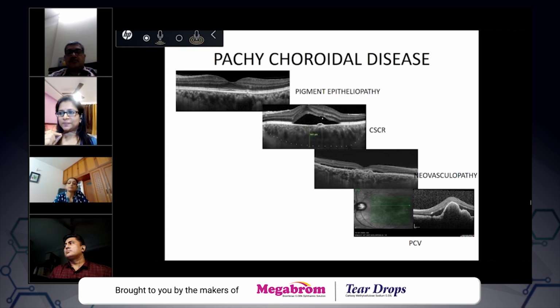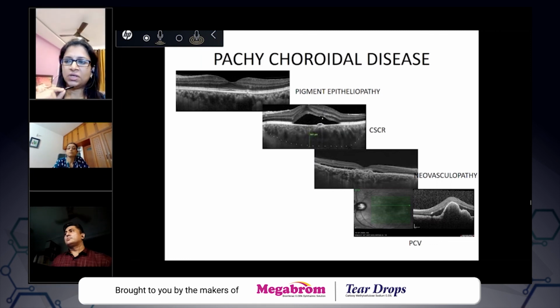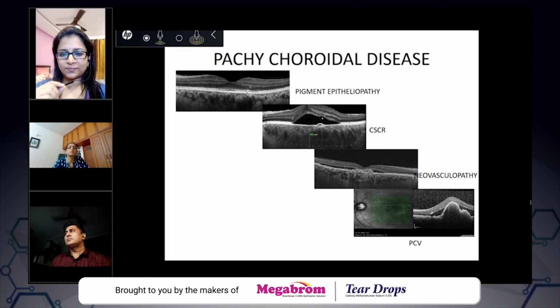Yes, sir, definitely. Sir, one more question is there in the chat box. Is there any role of fluorescein angiogram in disc edema to differentiate between inflammatory and ischemic cause? Yeah, see, you cannot actually, both of them will leak, but in some of these ischemic cases, for example, in anterior ischemic optic neuropathy, you can have a sectoral edema that can be very well differentiated with a fluorescein angiogram. So it has a role.